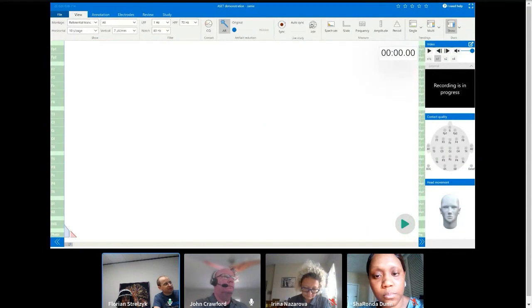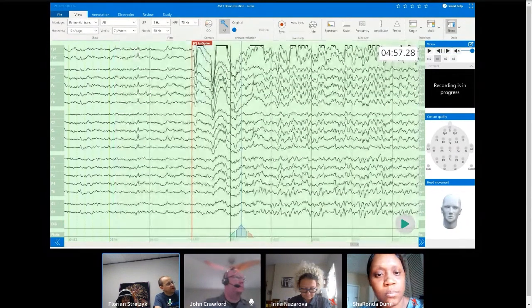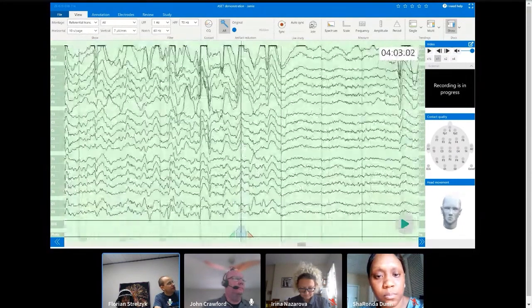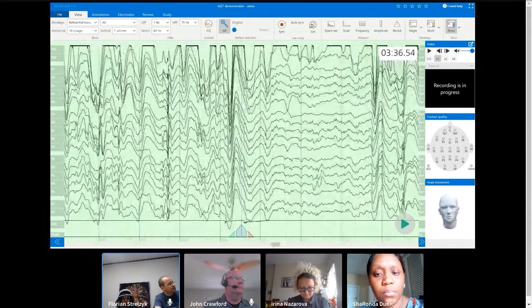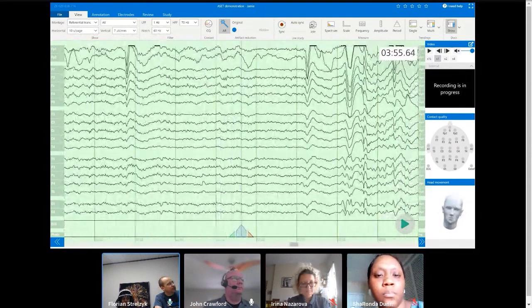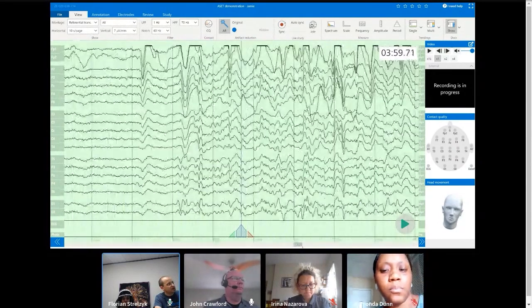Again, it depends a little bit on your scenario. If you really just want to triage a patient and see what's going on with them, then at this point, let's look for the first good data point that we had. You could have probably already started seeing seizure, no seizure at 3 minutes, 50 seconds. No, that would have been the first one. Probably around here, you could already see what's going on, if they're in status or not.